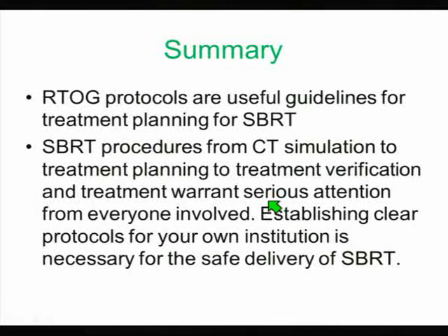Because sometimes the therapist says, "Oh, this is clear." How do you know it's clear? Lots of times they make assumptions, and sometimes they tell you it's not clear. Why is it not clear? "Oh, I cannot rotate to that side." But I'm not doing rotation to that side. I'm only doing a partial arc.